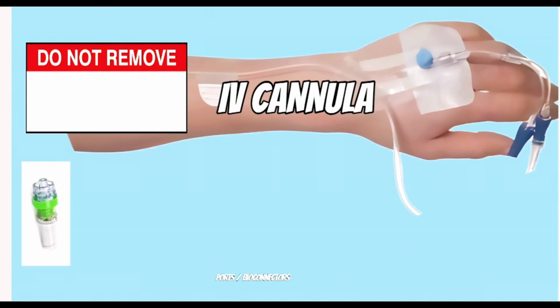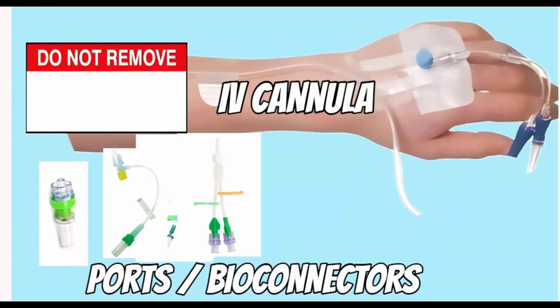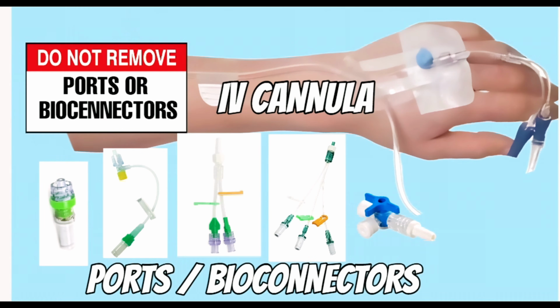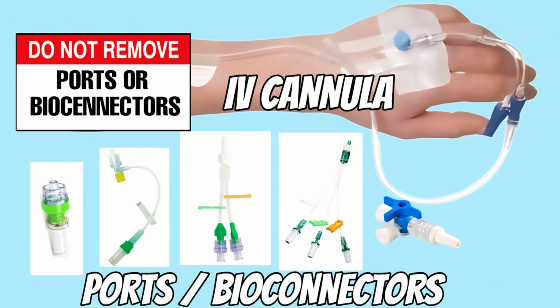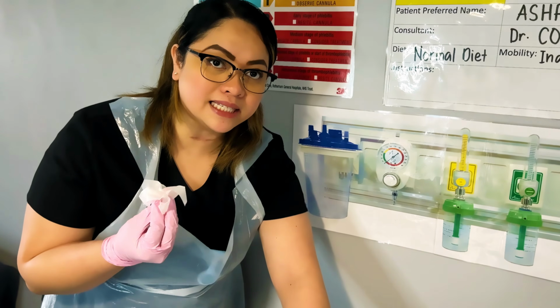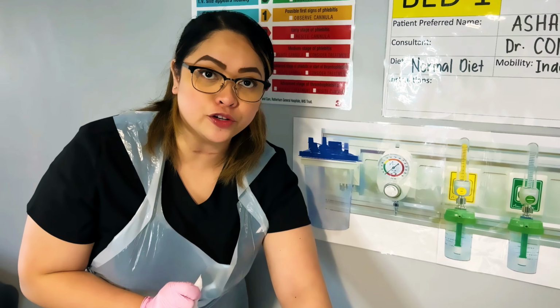These are the examples of ports or bioconnectors used in the hospital setting. Please familiarize yourself with all of them. Please do not remove any port or bioconnectors connected on the patient's IV cannula port. So assuming it's now 30 seconds, let the port dry for 30 seconds.